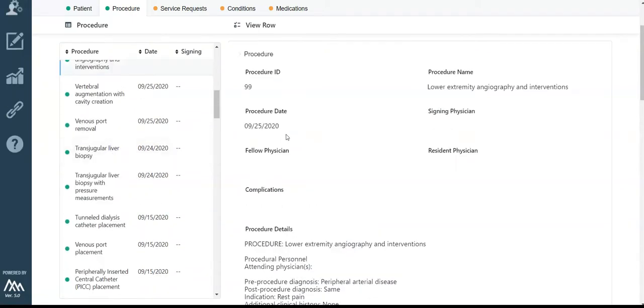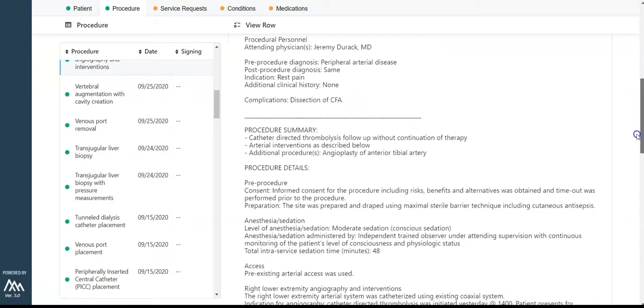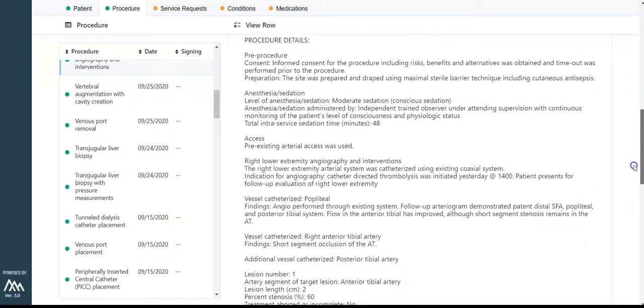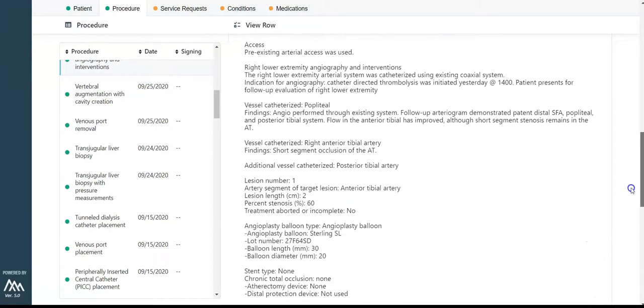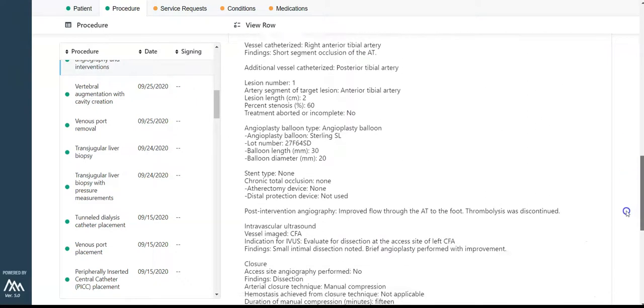If you scroll down on any procedure, you will see the raw dictation from your dictation tool. Coming soon is a feature to search the data within the procedure.